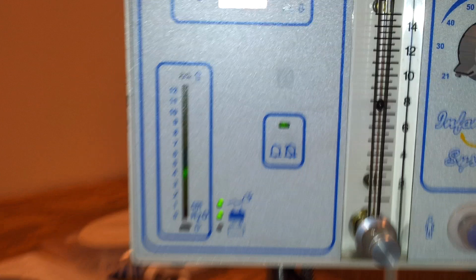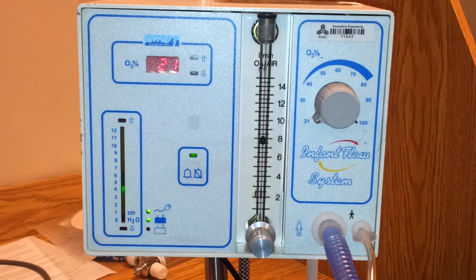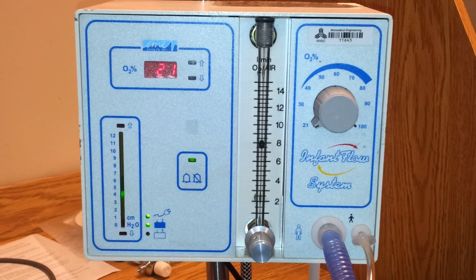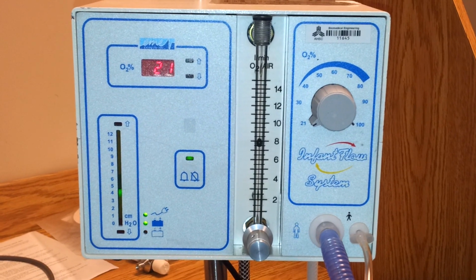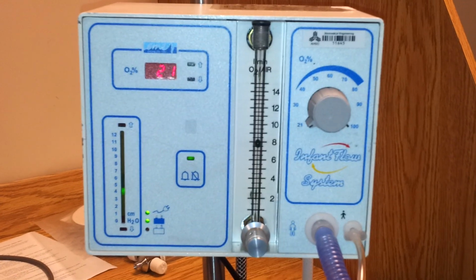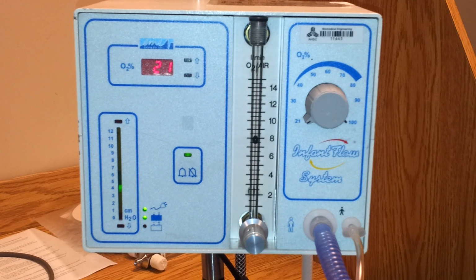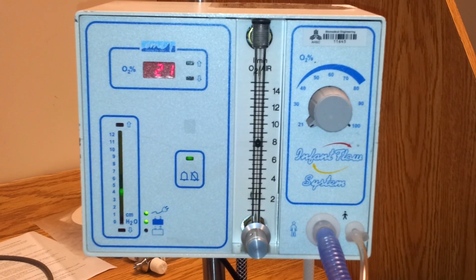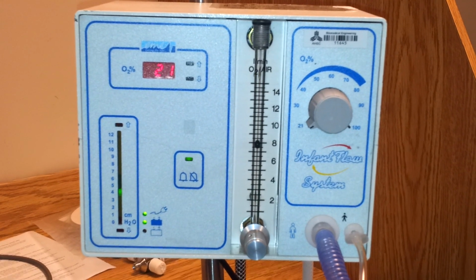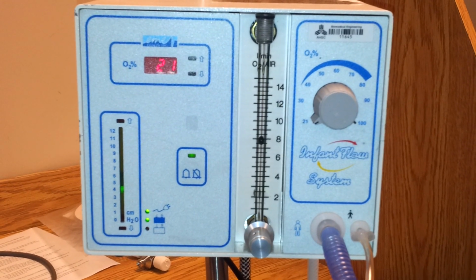So what we're going to go over first is basically what nasal CPAP does. It's used to increase FRC, increase lung compliance, it recruits alveoli, and improves oxygenation. The big indications for it are apnea of prematurity, so it stimulates the baby to breathe, respiratory distress syndrome, or RDS type 1, atelectasis, like I said, it recruits alveoli. A lot of people post-extubation go straight to this instead of just a little bit of oxygen. And tracheomalacia, it can also be used for, it just holds the airway open a little bit.